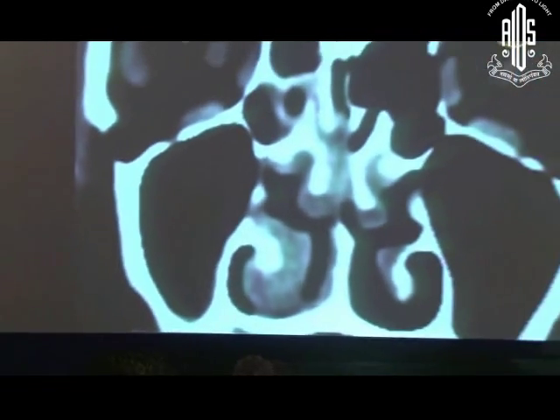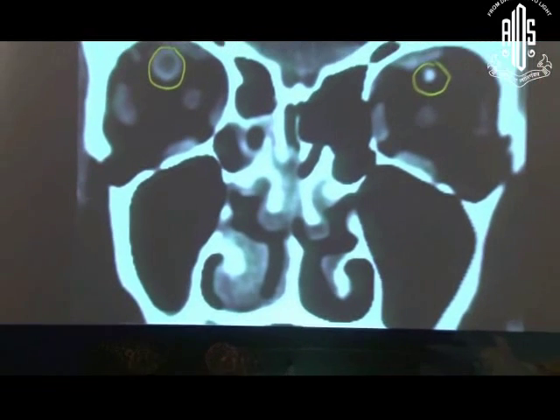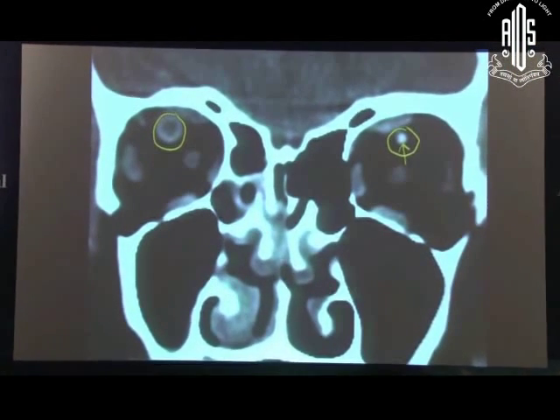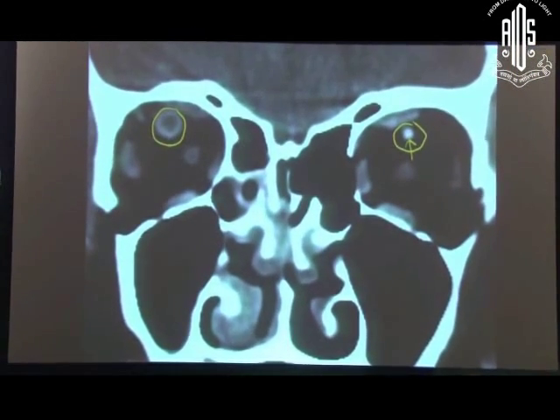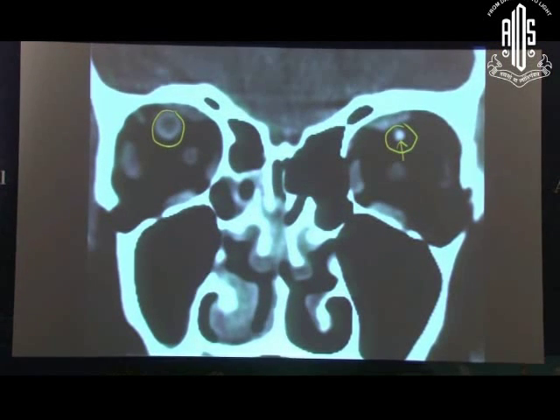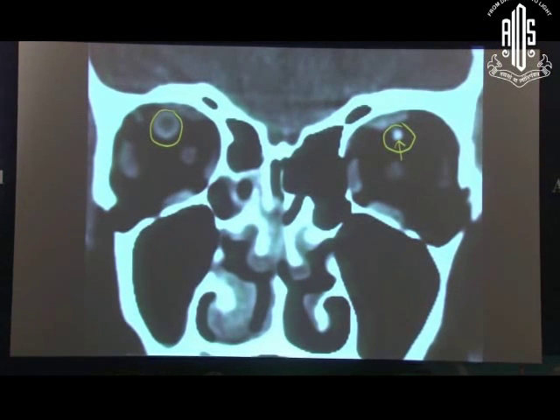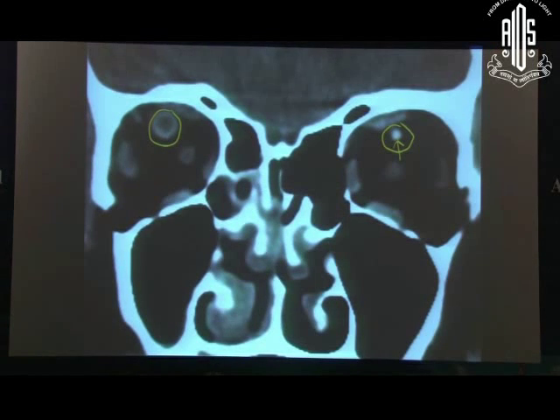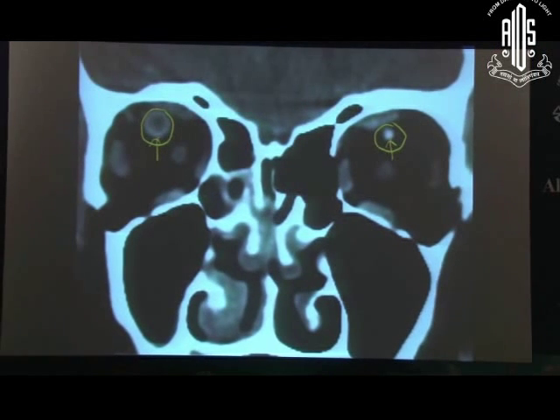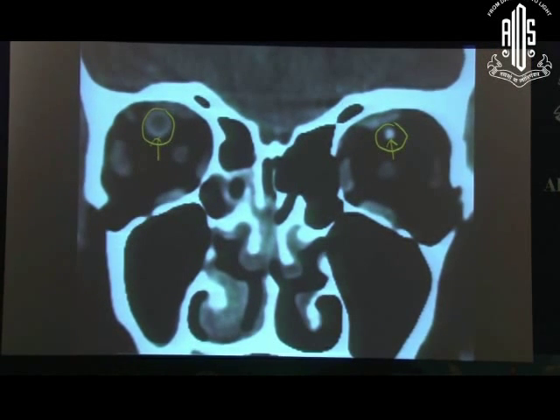There you are caught. If it is carotid-cavernous fistula, what would you find inside the dilated superior ophthalmic vein? If it were a fistula, would you find contrast inside? But there is no contrast inside as compared to the other eye. So what is it? Thrombosis — cavernous sinus thrombosis.